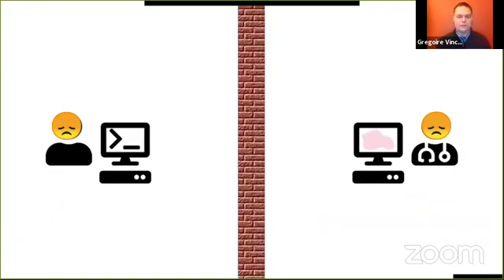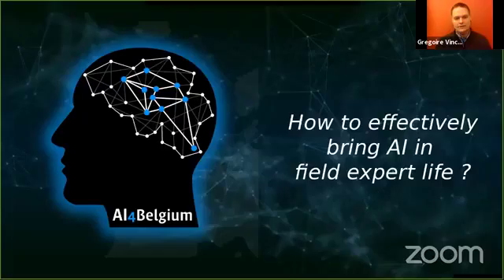So there is also a wall between the AI developers and the images, because as it's sensitive data, it's generally locked inside the hospitals where it is produced, or inside the laboratory when it's data that relies more on research. So we also need to have some bridges between the AI developers and the pathologists to be able to develop this AI.